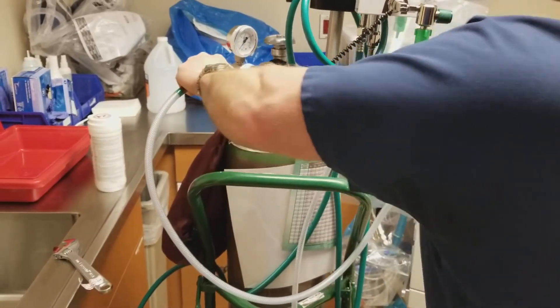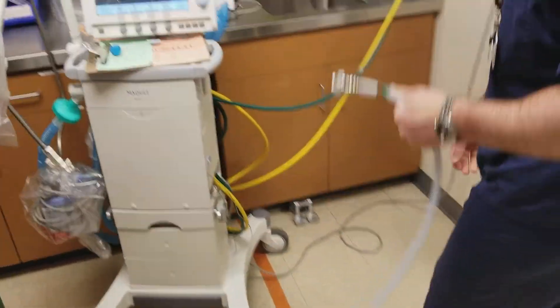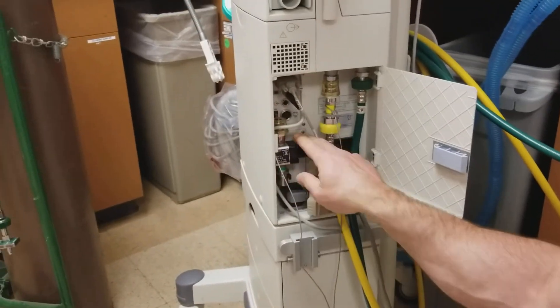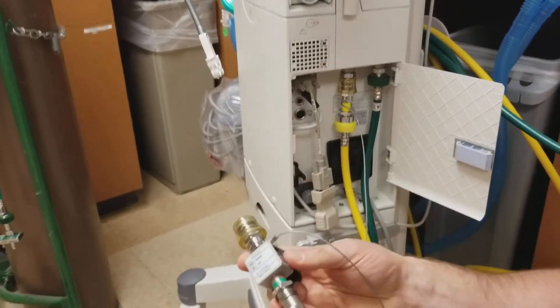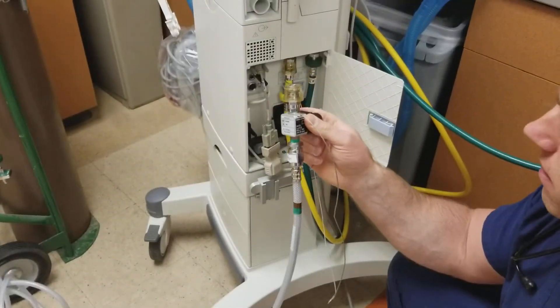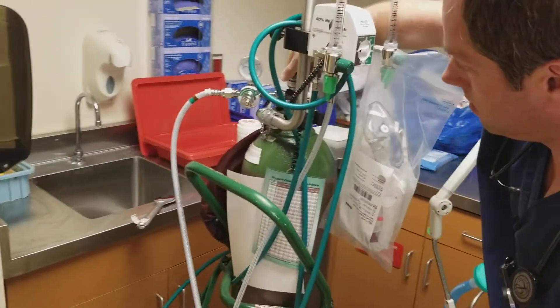The hose connected finger tight seems to make a decent seal. You can snug it up with a wrench if you like. Come over to the ventilator, open up the door. Down here we have our adapter — connect the helium, put that on. At this point we can turn the helium on over here — turn it on.